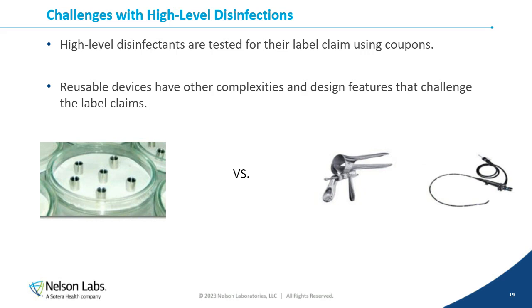And so it is not uncommon to see disinfection procedures for medical devices that extend past the label claim contact time for that high-level disinfectant. And it really just comes down to the fact that the medical device is more complex than the material used to evaluate the disinfectant. So that was for high-level disinfectants or disinfections.